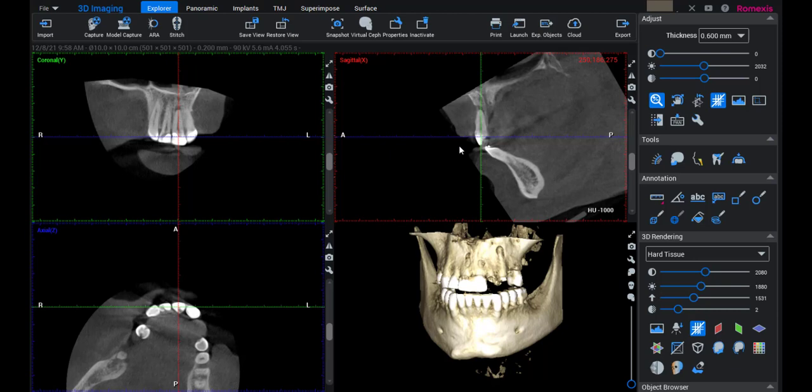If you're a team member setting us up to evaluate a single tooth, this is exactly the way I'd want you to do it. If it's a molar, these lines will be down the furcation and I can make slight adjustments to evaluate the canals. If you see something obvious on the mesial canal, you can line up on the mesial root and mesial canal just like this.